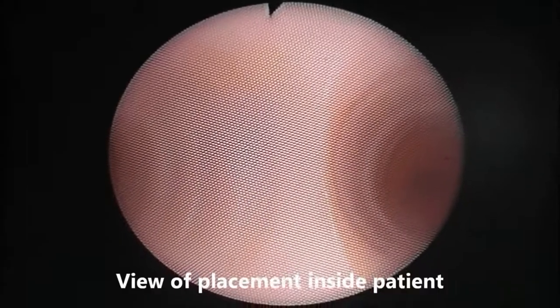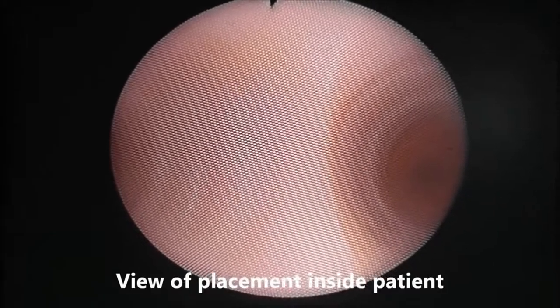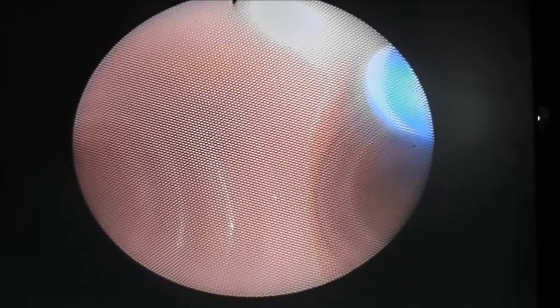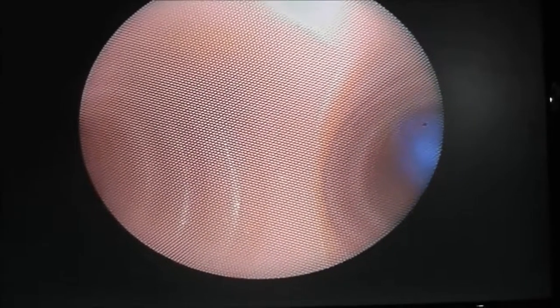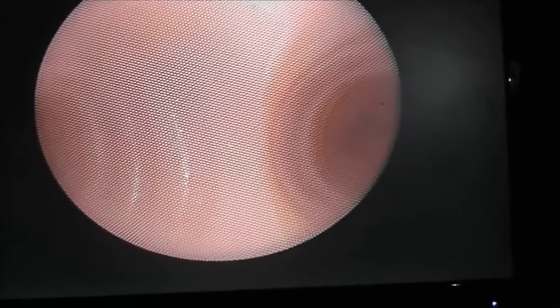Once you've intubated the patient, go ahead and advance your fiber optic scope down the endotracheal tube to the level of the carina. Once there, advance your bronchial blocker to the same level. And using a twisting motion, you can direct the bronchial blocker into either the right or the left main stem. To isolate the right lung, use a clockwise turning fashion on the bronchial blocker to direct into the right main stem. If you want to isolate the left lung, use a counterclockwise twisting method to direct into the left bronchus.